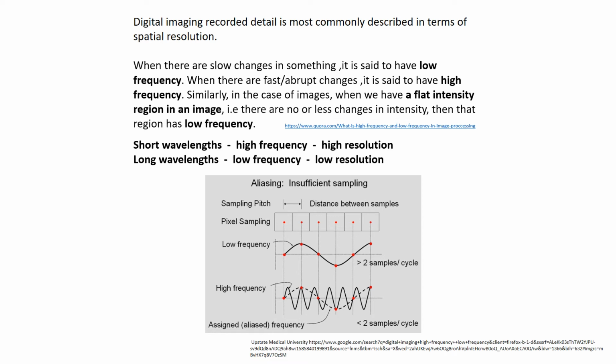These points are going to give the computer information. And when we compare the low frequency to the high frequency, the computer is able to look at more of these waves or points on the wave. We'll talk more about this a little bit in this course, but like I said, you're going to talk much more about this in your digital imaging course.